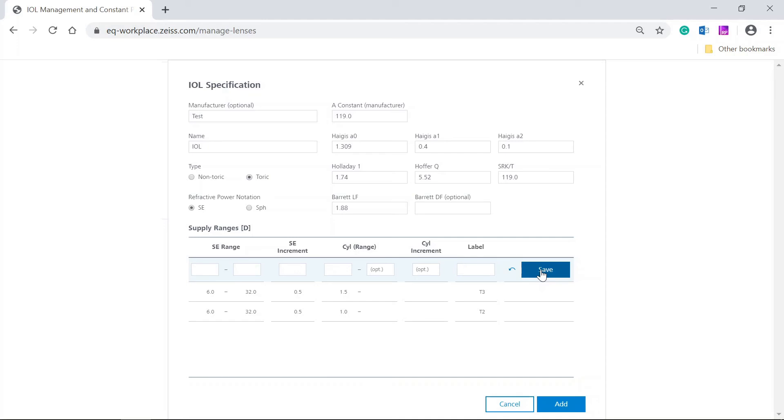Enter all the delivery ranges for the TORIC IOL as required. You can add as many lines as you need to cover the supply range of the IOL. Make sure you have entered each delivery range line correctly before you click on save. You are not able to edit the delivery range once it has been saved. You can only delete it and enter it again.